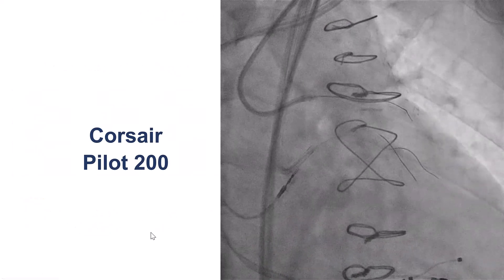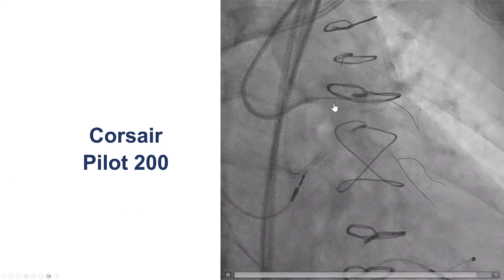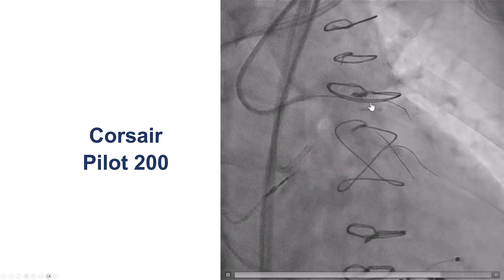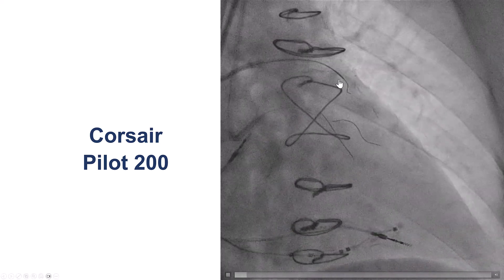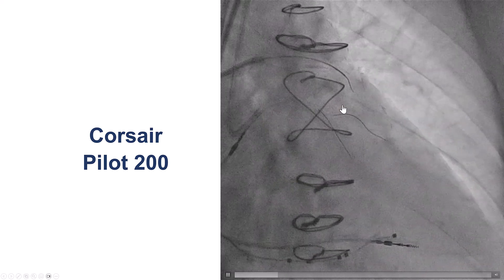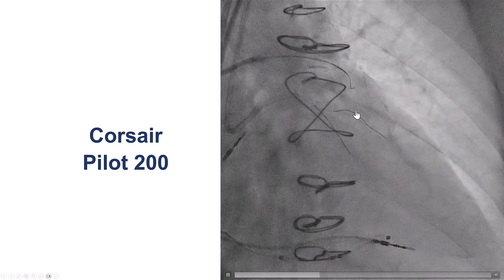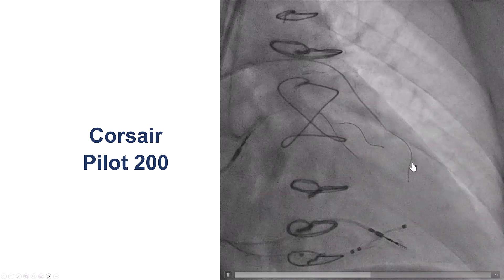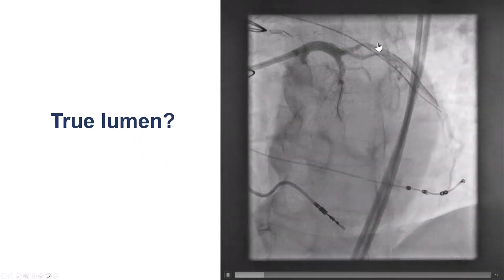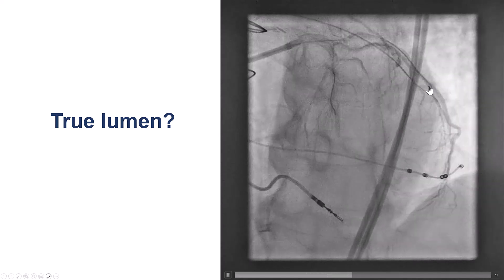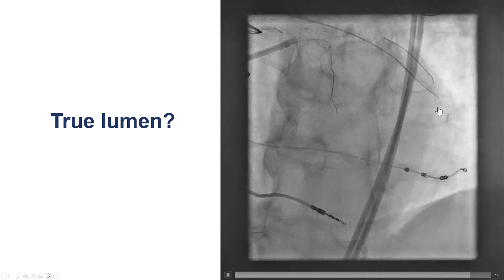To cross the vein graft, the usual approach is to use a microcatheter — a Corsair — and a polymer-jacketed guide wire, a PILOT 200. We made good progress going through the vein graft. It did require some redirection, and sometimes we used contrast injection to guide our crossing. Eventually, the wires seemed to go along the course of the vessel. To confirm, we did injection through the left main, and we could see that we were in the true lumen distally with delayed filling.